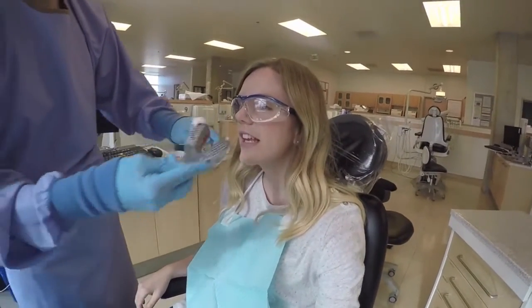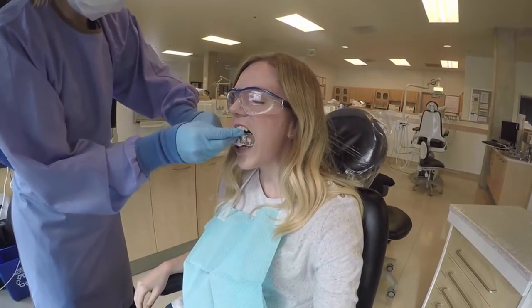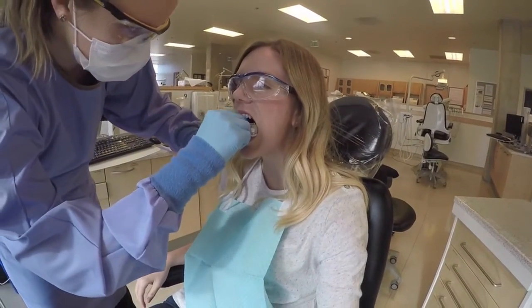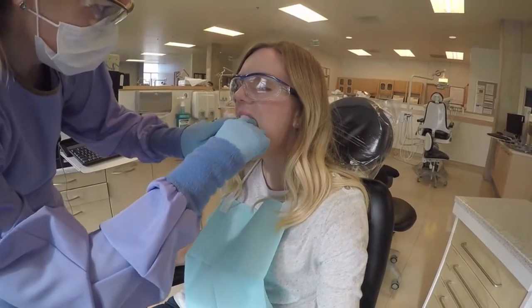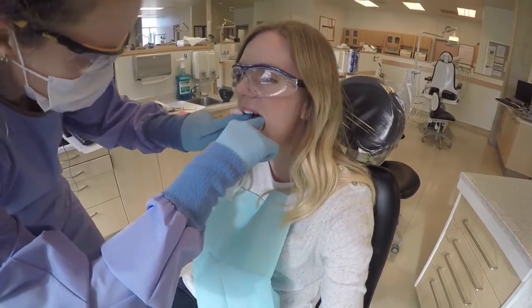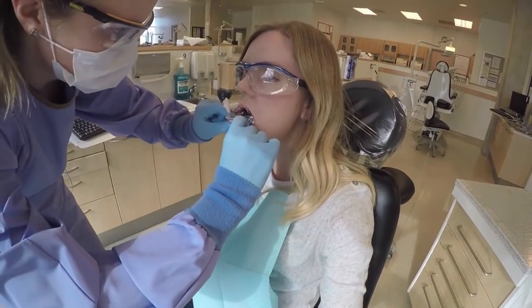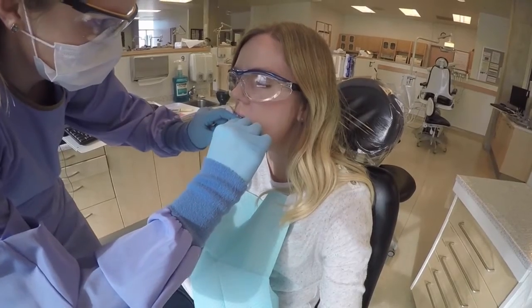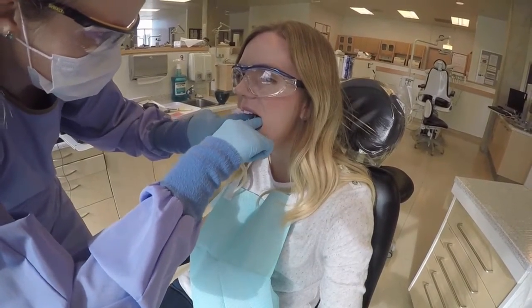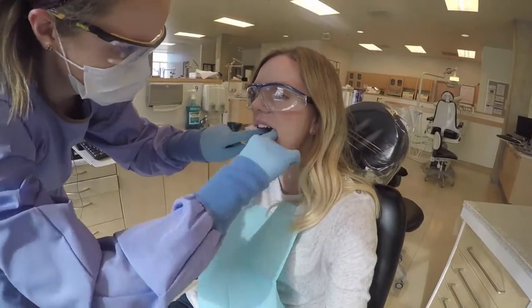Insert the tray into the patient's mouth in a sideways orientation and then move it to match the arch. Seat the posterior portion of the tray over the teeth and then press forward, pulling the lips over the front of the tray once you have set the impression over the arch. Keep your fingers over the top of the tray, checking for the material to set. You will know the material has set once it feels somewhat rubbery.